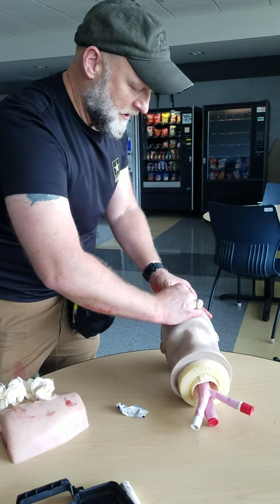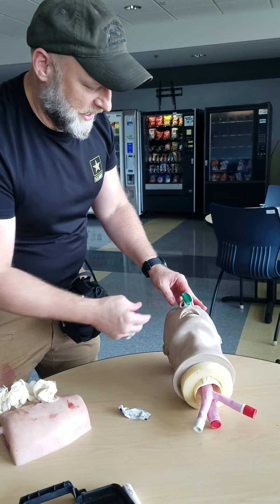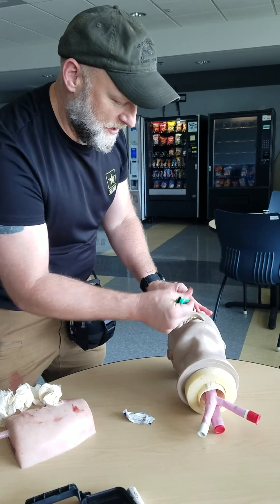I open the airway and reassess. If there is head damage, I would not use the NPA.